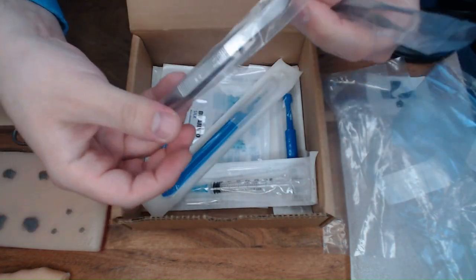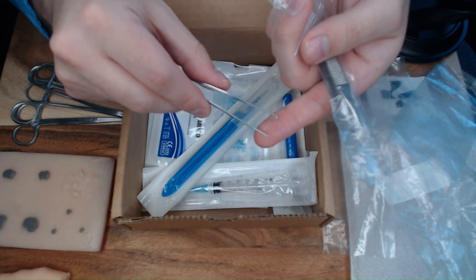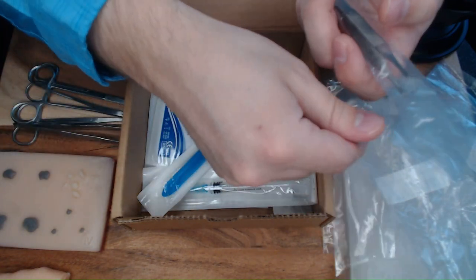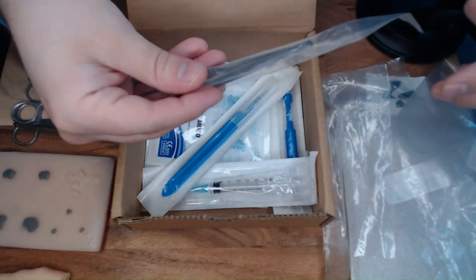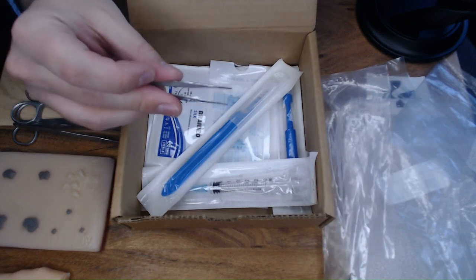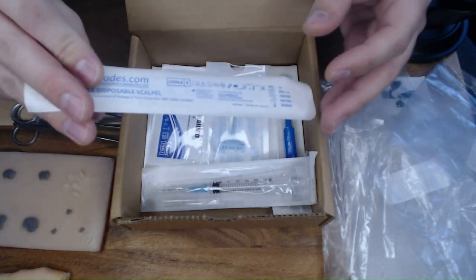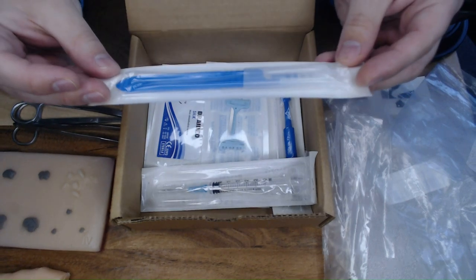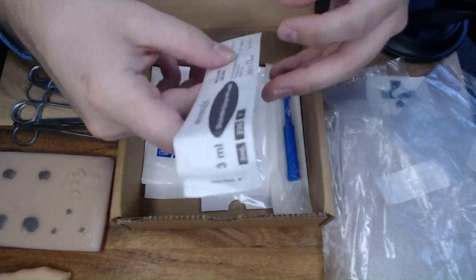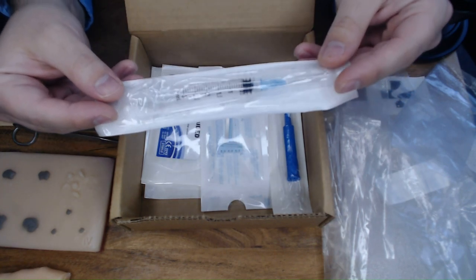Also included for that added bonus is a needle driver. There are two options for forceps or pickups: one option has teeth, which is great for grabbing tissue, and the other is the same type of forcep pickup without any teeth on the ends. Also in your kit you will get a scalpel. We did our best to find products that mimic what you would see in practice, so it's great to get your hands on actual instruments and supplies to practice with.